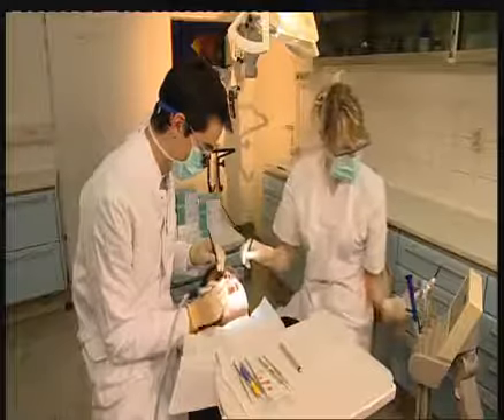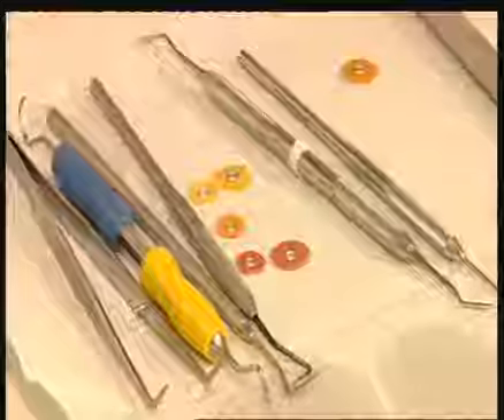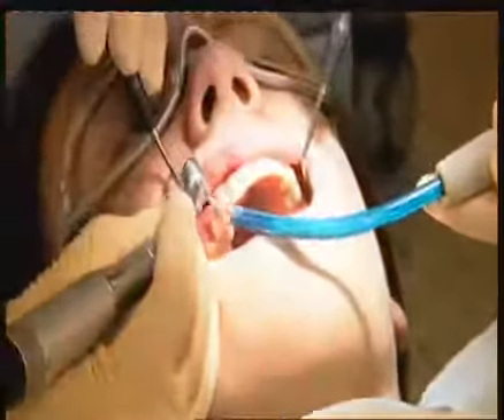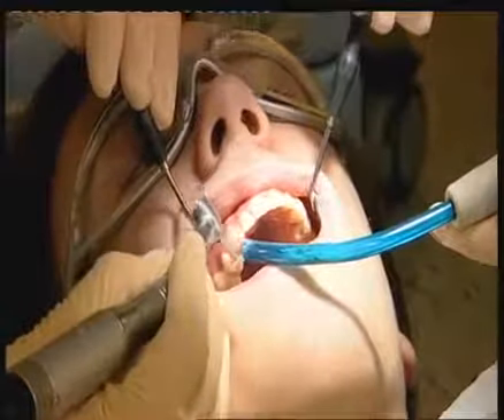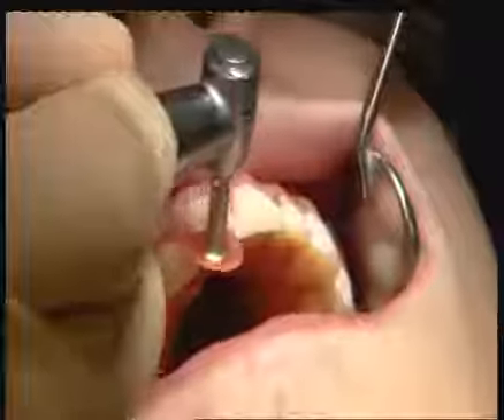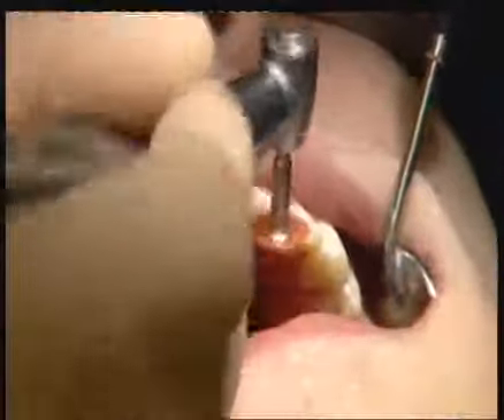After a successful treatment, the restored area is finished with fine polishing aids and the surrounding hard tissue is polished. A further advantage of this innovative treatment method is that it does not change in any way the anatomical shape of the tooth. ICON combines state-of-the-art dentistry with the patient's wish for drill-free treatment of their teeth in order to protect and preserve healthy tooth structure.